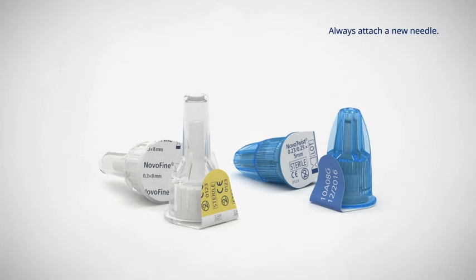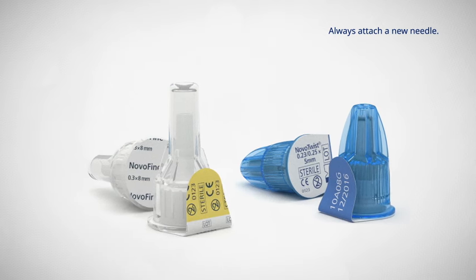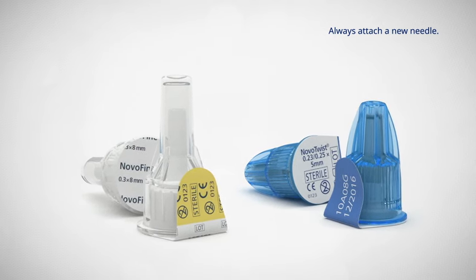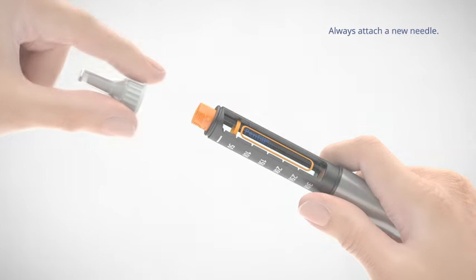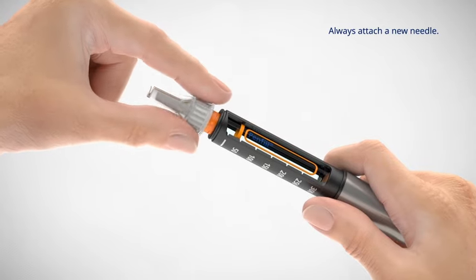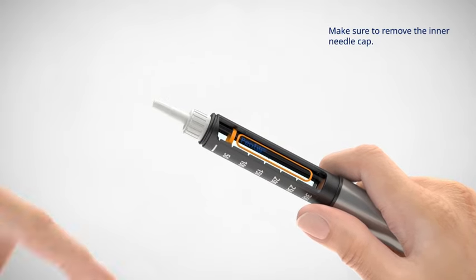Right before injection, always attach a new needle. This reduces the risk of blocked needles, contamination, infection, and inaccurate dosing. If using Novo Fine, screw the needle straight and tightly onto the pen.